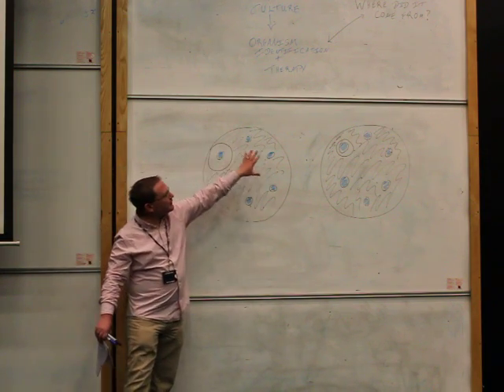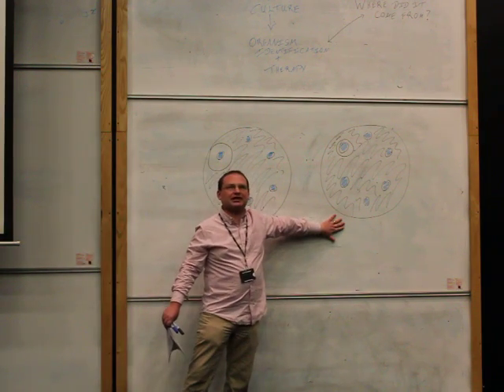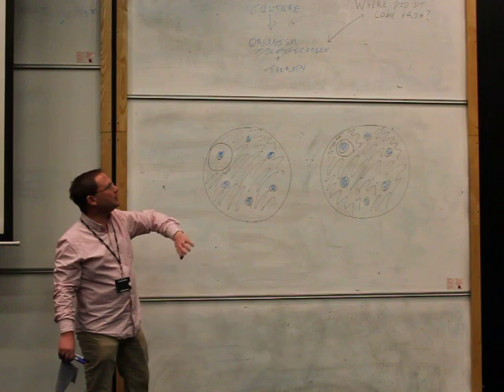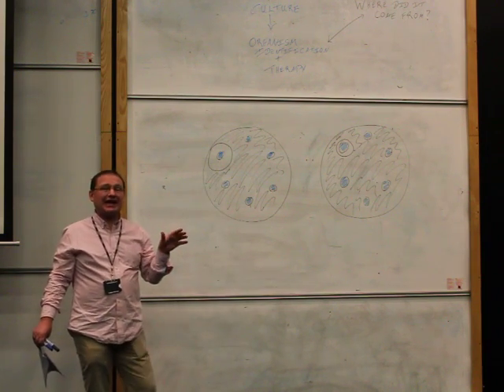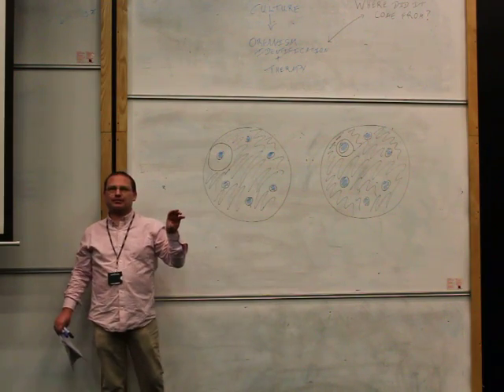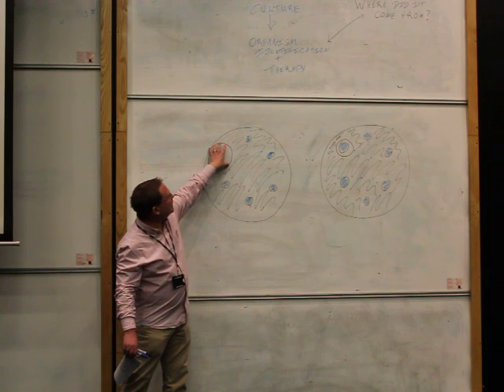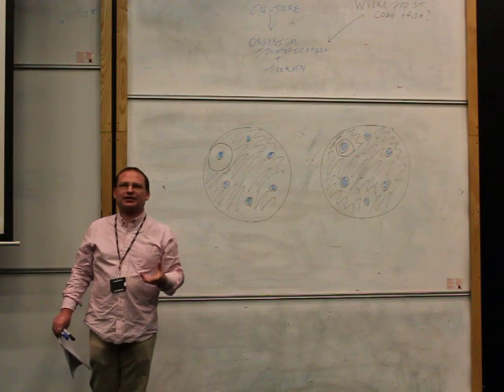So, you will have a picture of a control plate, and you will have several pictures of test specimens. They have the same antibiotics on them, and they've been seeded with your organism. You need to compare the zone of inhibition, the zone where there is no growth around the disc. So for this disc, we know that the zone of inhibition is so big for your control organism that indicates sensitive.